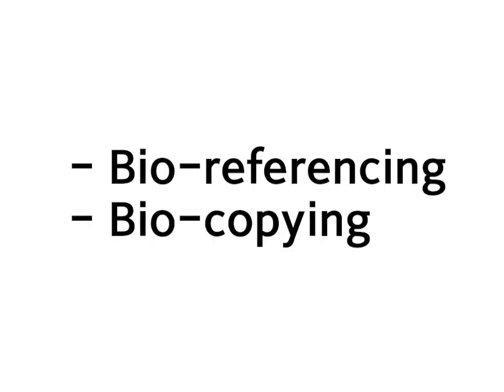The software can propose a design for the anatomy of the final restoration through mathematical algorithms by relying on the anatomy of another tooth in the patient's mouth, known as bioreferencing, or by relying on a scan of the provisional prosthesis or the original tooth prior to extraction, also known as biocopying. The two words, bioreferencing and biocopying, should be remembered.